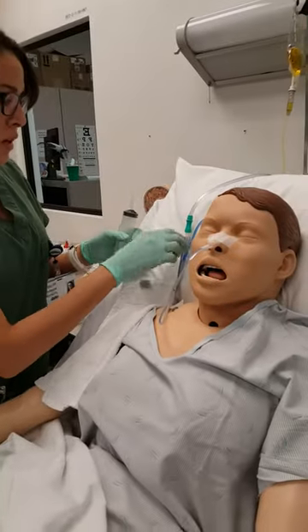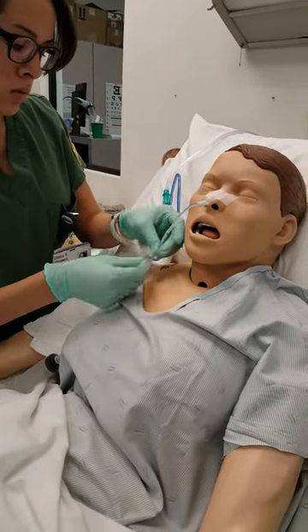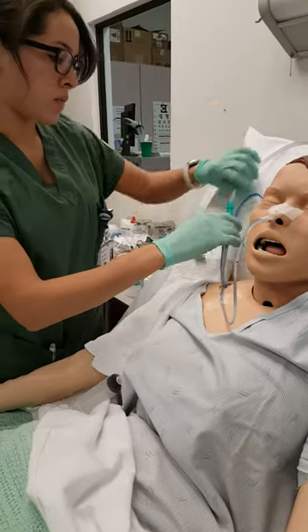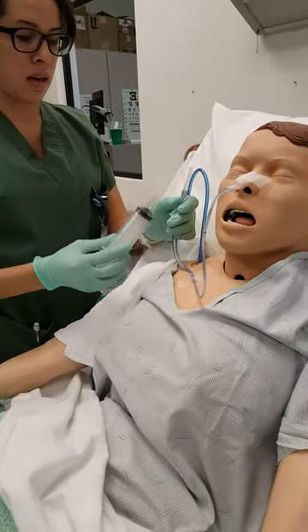I'm just gonna set this right here, okay? Sorry, this tape isn't sticking really well. Yeah, I have plastic skin. You have plastic skin? Yeah, it feels like it. That'll make it hard.